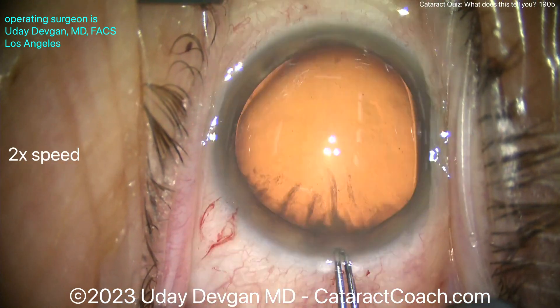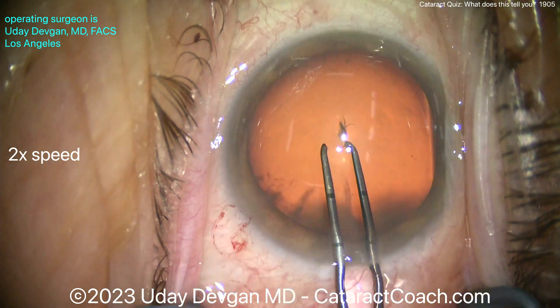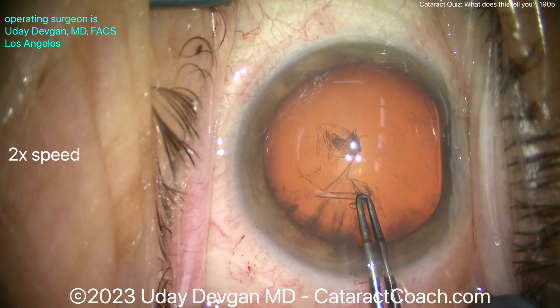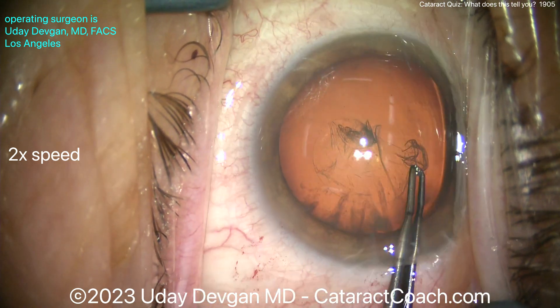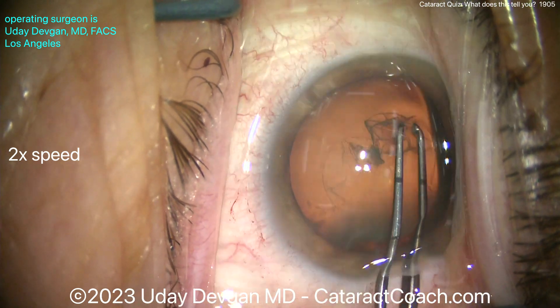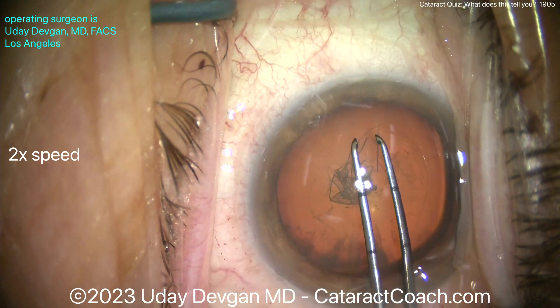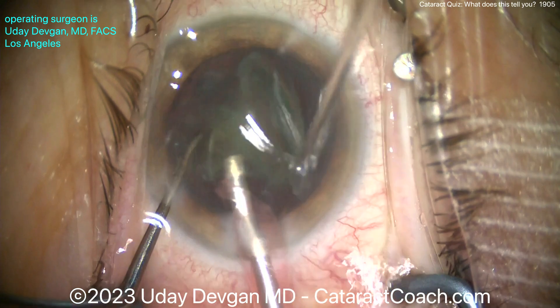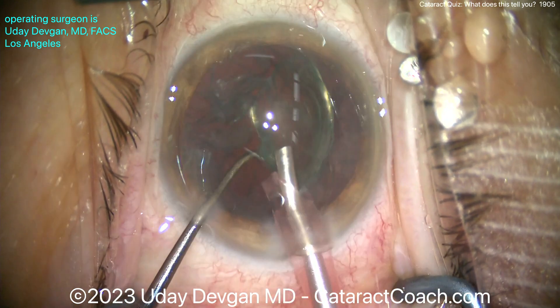This is a normal rhexis. This is the incision made with a diamond. Here we're measuring out — we want a five millimeter rhexis. This video is sped up a little bit just to show you there's no wrinkling of the bag, there's good support, everything looks normal. The rhexis doesn't run out; we're able to create that five millimeter rhexis. Let's measure it — boom, five millimeters.